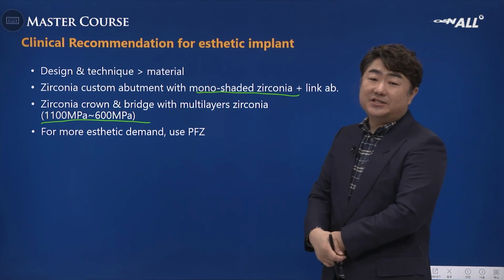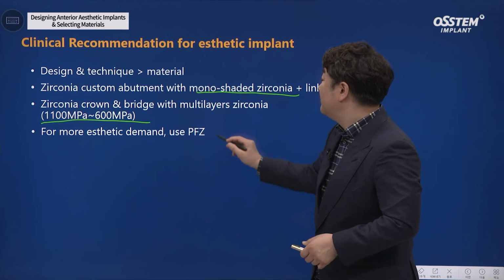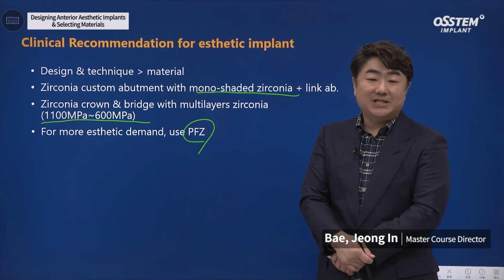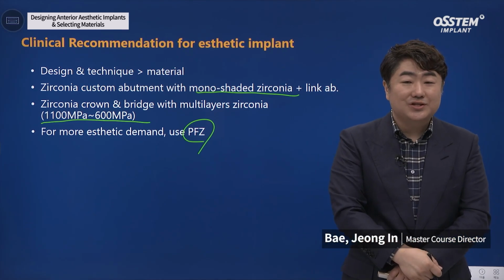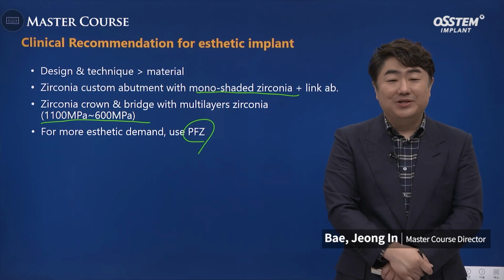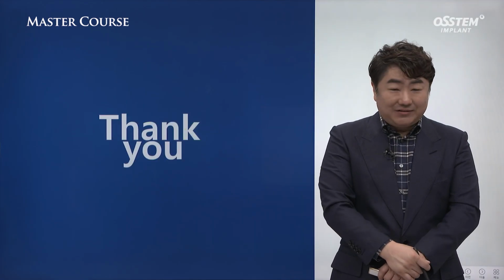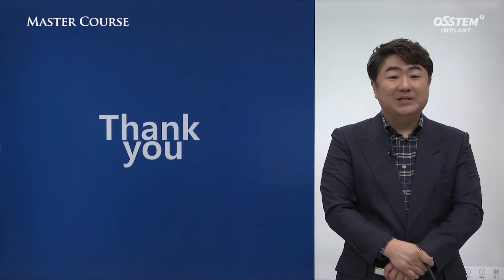Such a zirconia block can be used for single implant cases, or when aesthetic demand is very high, you can use a PFZ, which utilizes veneering powder. Thus far, I've talked about design and materials. You'll be able to get more details and do hands-on practice in the offline course. Thank you.